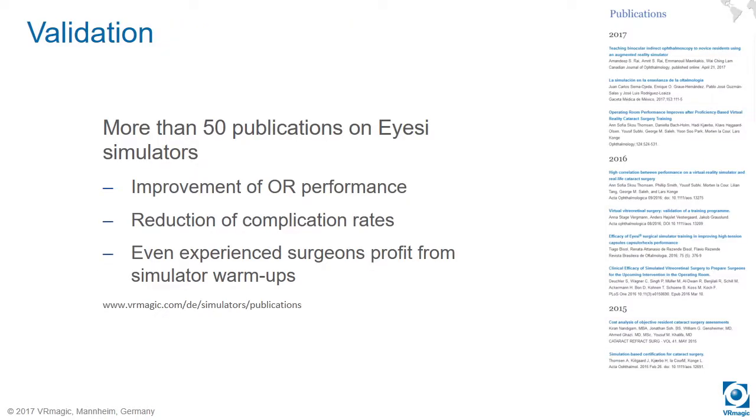There are more than 50 publications on our simulators. They prove dramatic improvements on complication rates, especially on beginners. I think the largest number was 70% within the first 600 surgeries of residents.